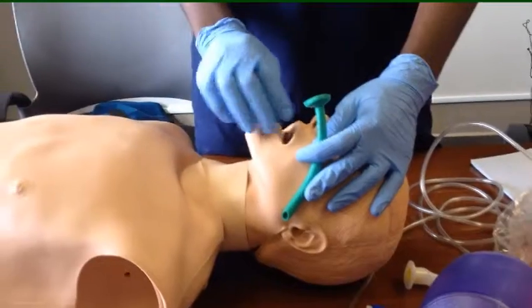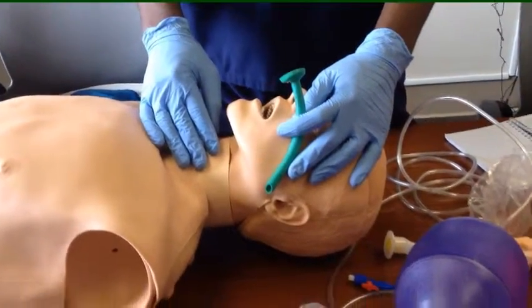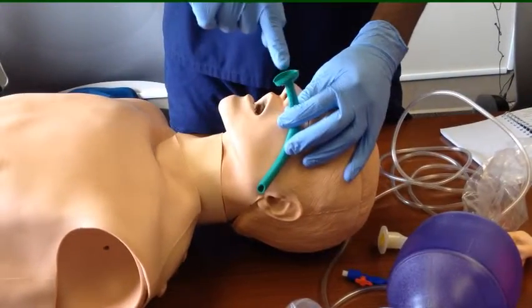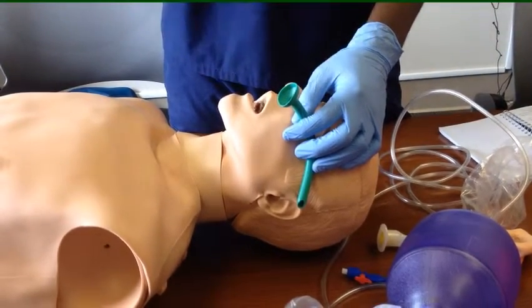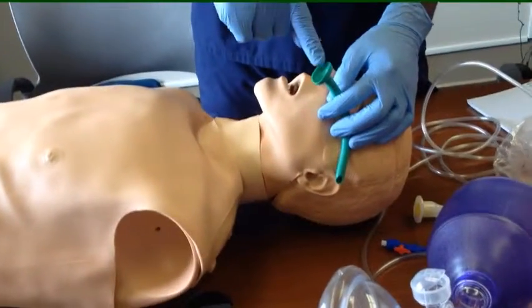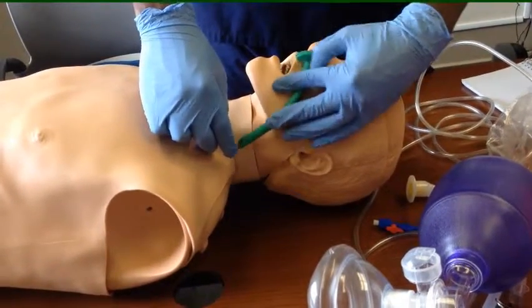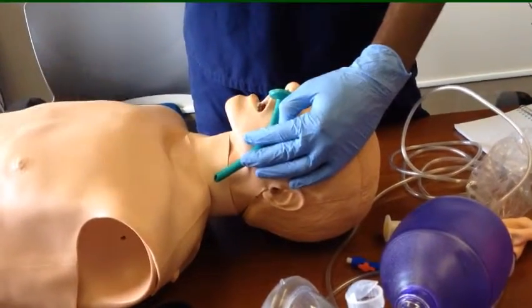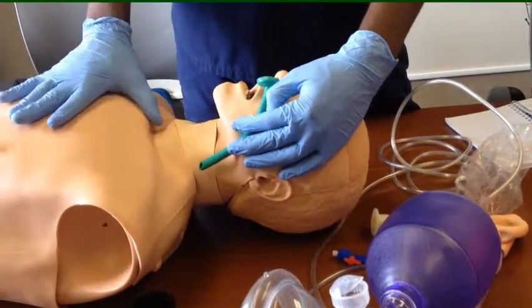Another thing to remember is that when you have the nasopharyngeal airway in place, it makes it easier to suction the back of the throat without causing trauma to the nasal septum. Why? Because the NPA has a hole in between, so you can use a small suction, like the one you use to suction a trach. You insert it through this hole, and it comes all the way to the back of the throat. Let's assume this is inside the patient. Then it's going to suction out all the secretions, opening up the airway and making it easier for the air to go inside the lungs when you're bagging the patient.